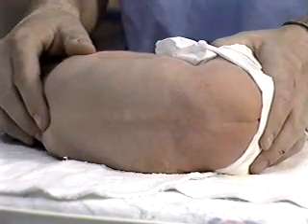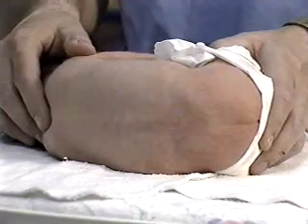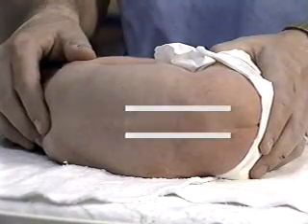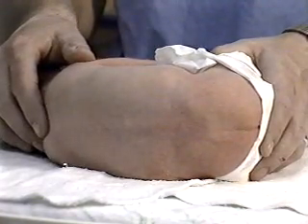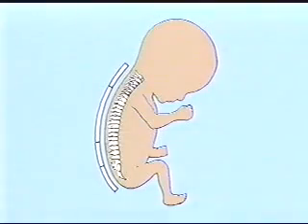The lower spine must be adequately flexed to provide maximal separation of the vertebral bodies. The neonate should be held in a flexed position with the spine parallel to the table. At this point, the infant should not be rotated, as this will affect the position of the vertebral bodies and interfere with access to the subarachnoid space.